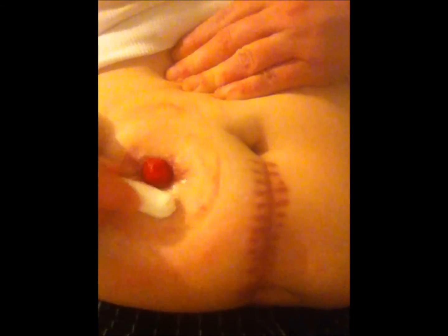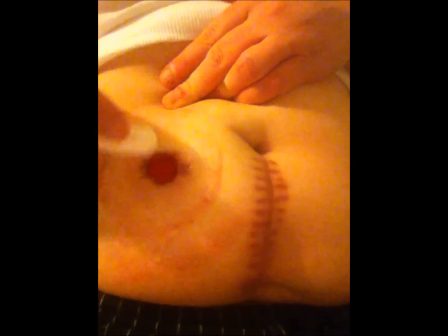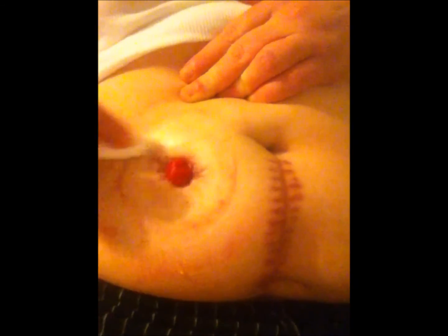This here is very important because it comes to you one size and you have to fit it. So what I do is, first I've got to take out the Tampax because my ostomy does leak and I don't want urine on my body. So I use that Tampax for that.